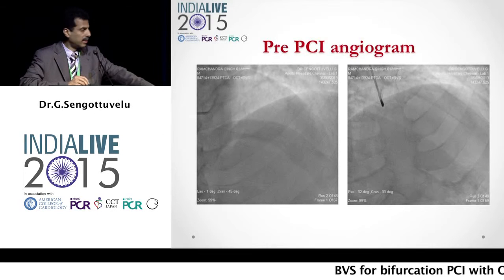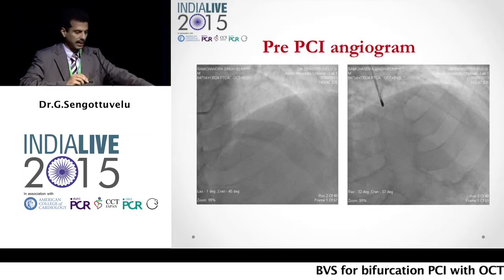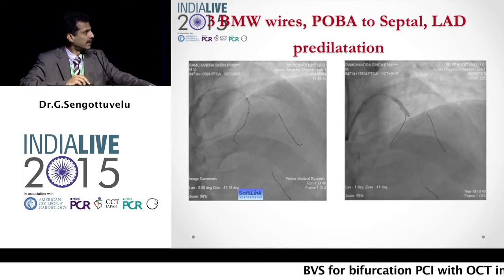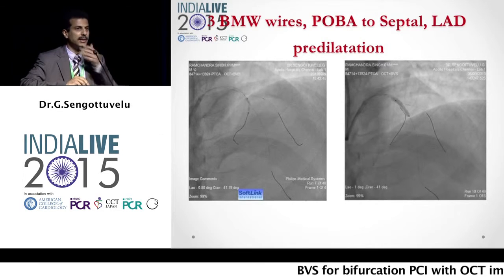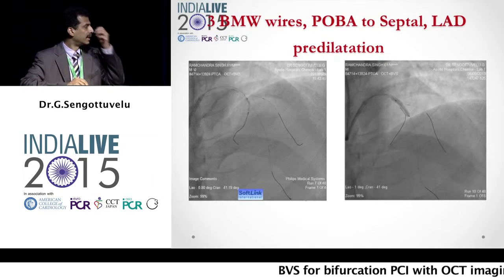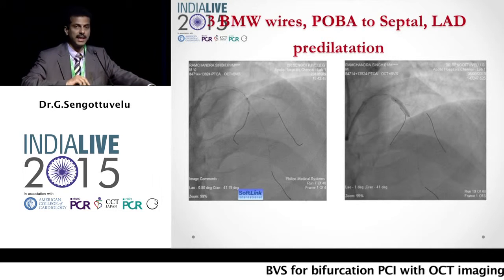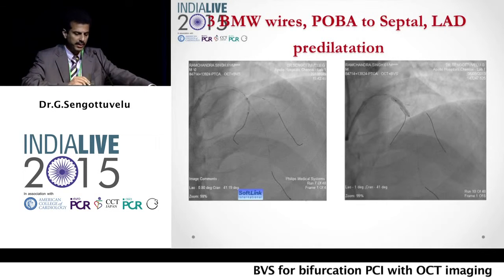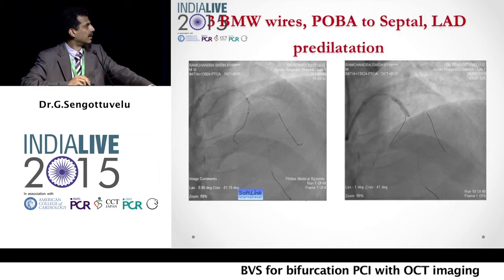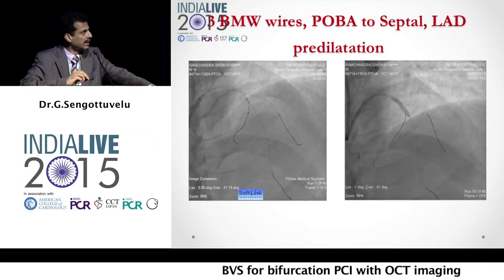We put in three wires — the LAD, diagonal, and the septal. We did a balloon dilatation of the septal and then predilated the LAD aggressively, as it is very important before BVS deployment.